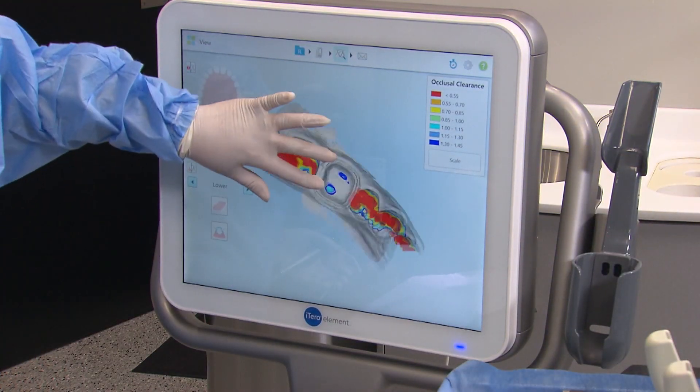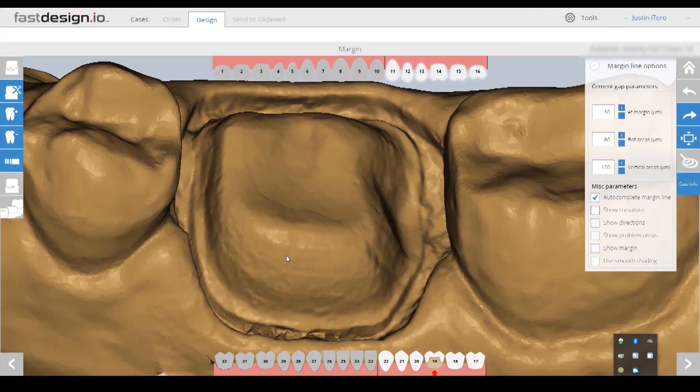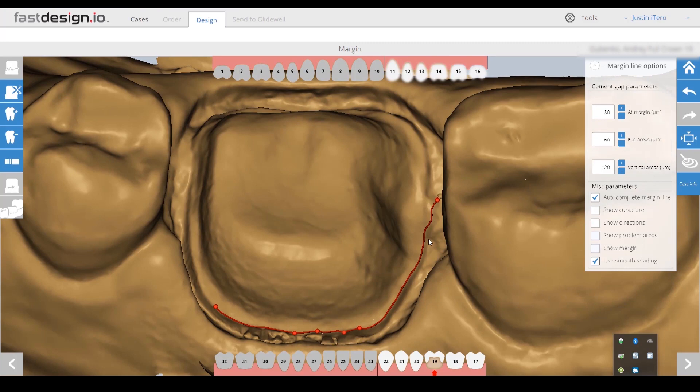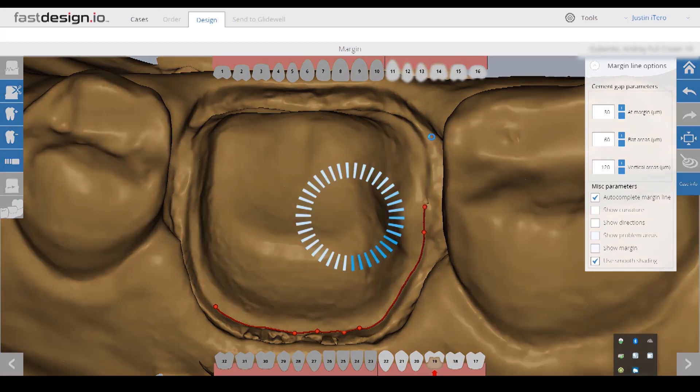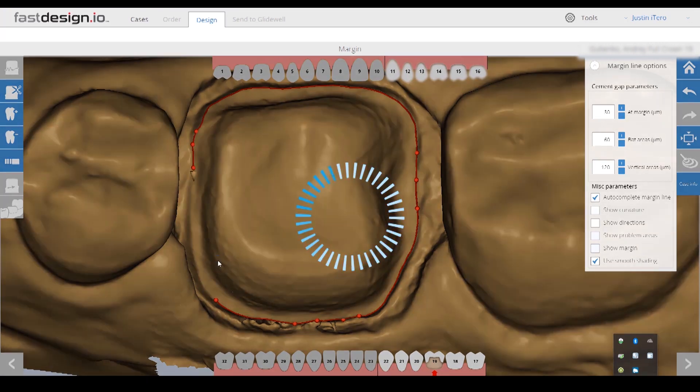Once I've captured the upper, lower, and bite, the digital models are transferred to the Fast Design workstation where the first step is to identify the margins. I'll guide the software with a series of clicks along the prep. This step is made easier by creating a sharp cavo-surface margin and providing enough tissue retraction.